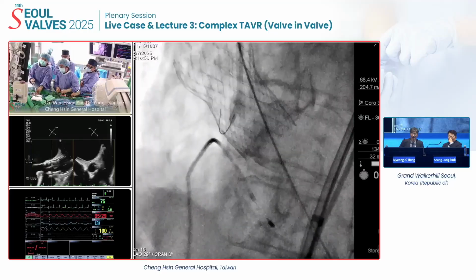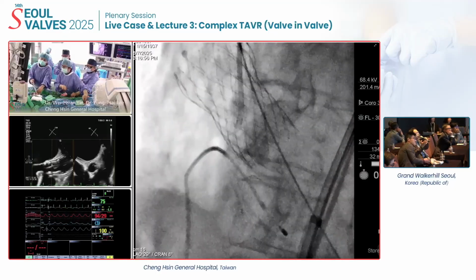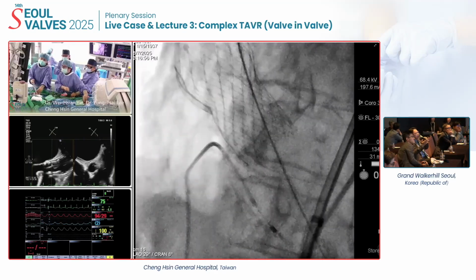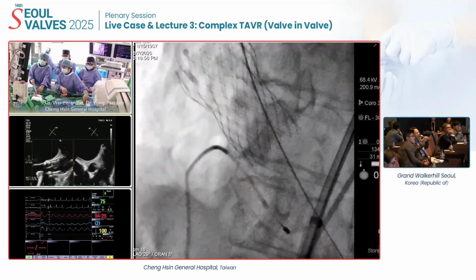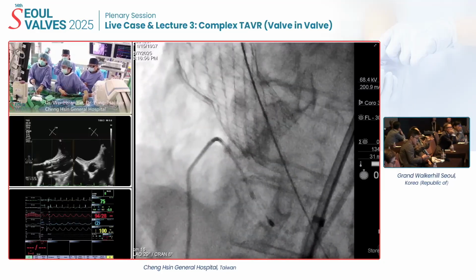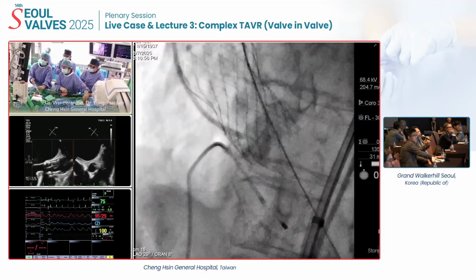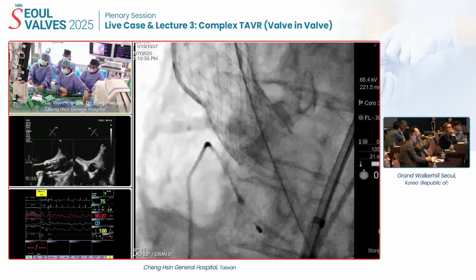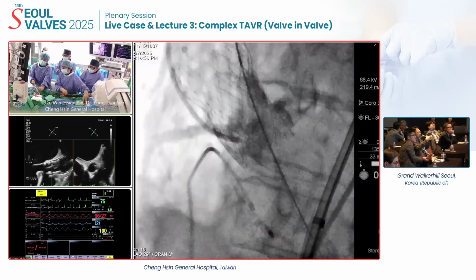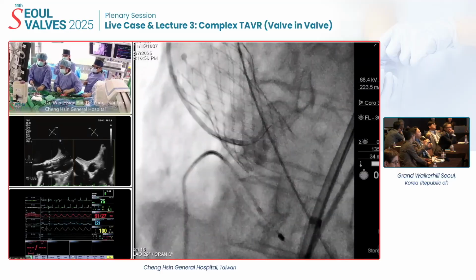That's correct. I think for the BASILICA procedures, if you lacerate the valve, then usually these sort of patients may have very severe aortic regurgitation, something like 4+ AR, and then hemodynamically they will deteriorate. But you can see in this sort of procedure, as my colleagues have mentioned, with very controlled dilatations, the patient is hemodynamically quite stable. Even from the TEE, if you monitor it closely, usually the degree of AR may not be that severe.